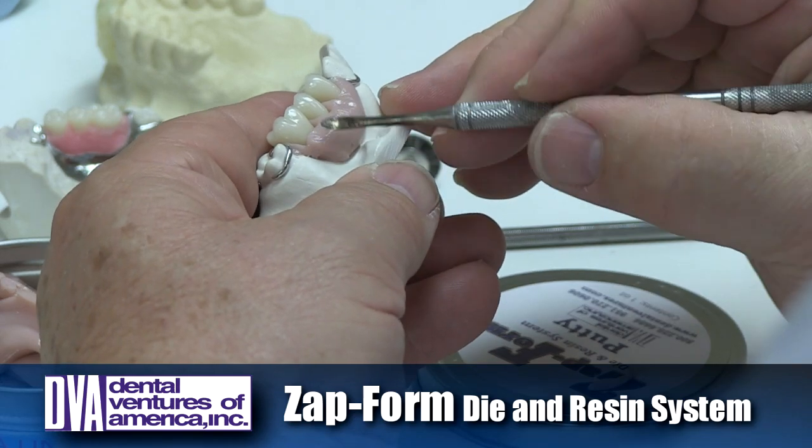We'll let this cool off. While this has cooled off, we're ready to divest. We simply pull the material off. If there's any residual putty, you just pick it up like this. Now we have a nice clean matrix that's ready to go. To get any residual putty off the framework, just pick it up with some of the putty itself, because we can reuse this putty over and over again. To get it off the model, simply push the putty onto the model — and look at that, the model is clean as a whistle.